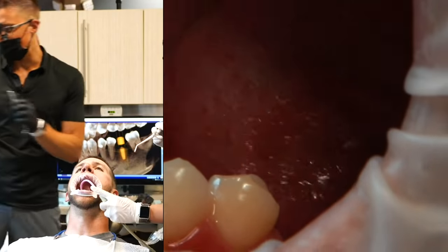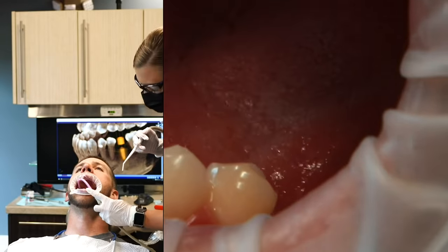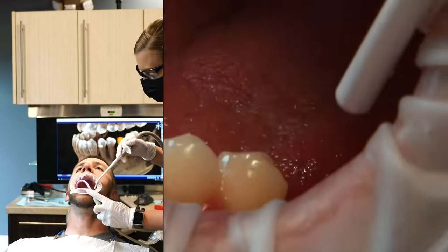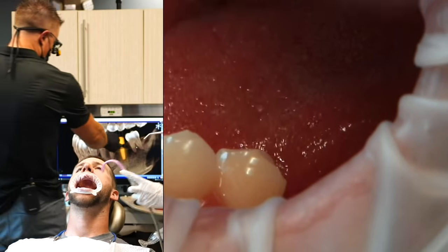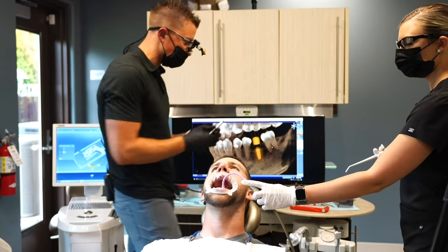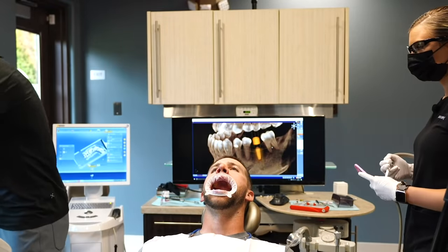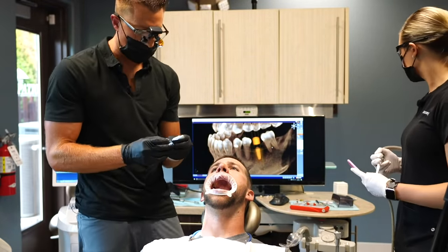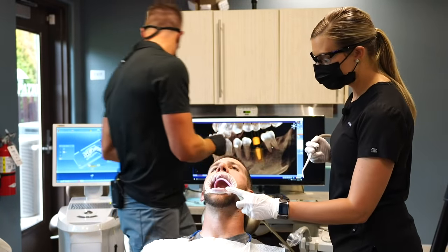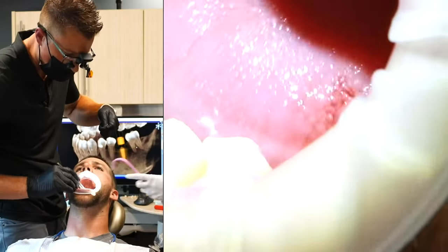You can see it's purple inside. That's because that's just the size of connection. It's a color-coded system. So the next thing is, now that we've got the implant in place, if we look at this image here, we have tissue and bone on either side of this implant that we want to make certain don't cause an issue with our placement of our future crown and with our healing cap.